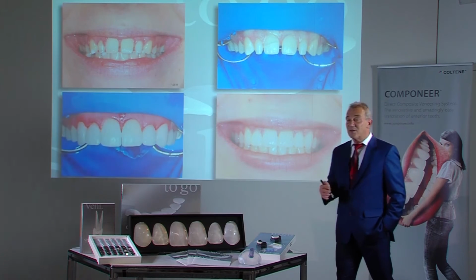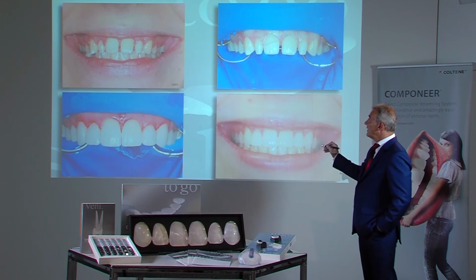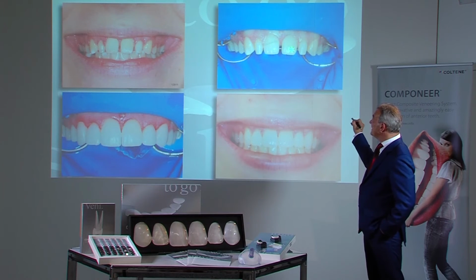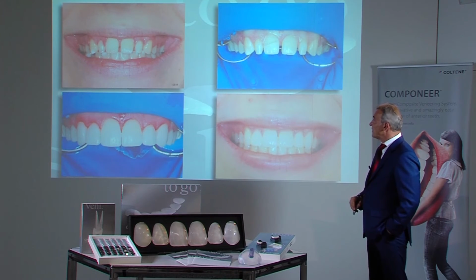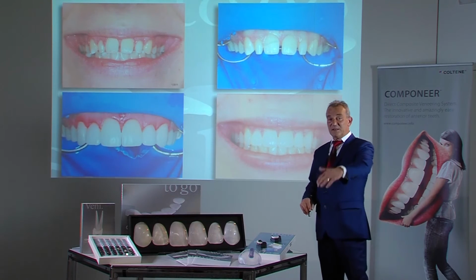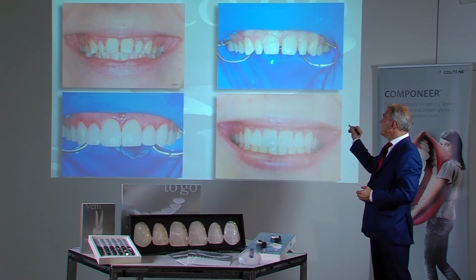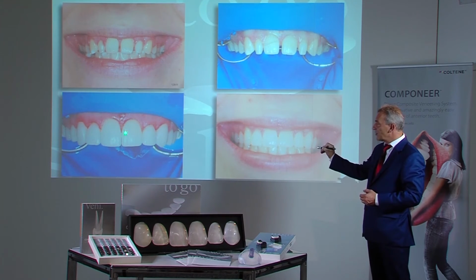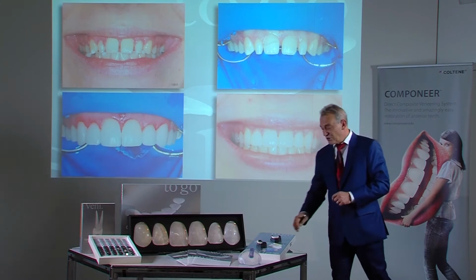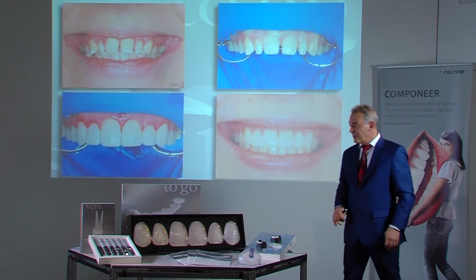More difficult are the diastemas following orthodontic treatment. In this case, the patient still has a retainer. This often creates difficulties when building up a base from interdental to buccal. One therefore only has the option of building up interdentally, starting from the tip of the papilla. Nonetheless, this can be achieved with a small piece of matrix in order to be able to finally close this gap completely.